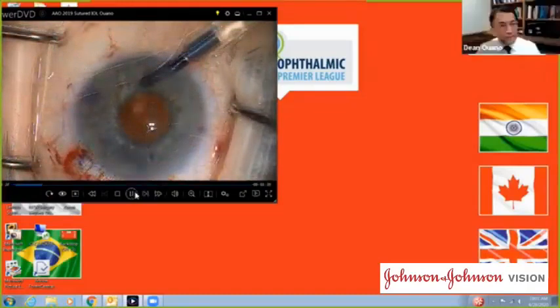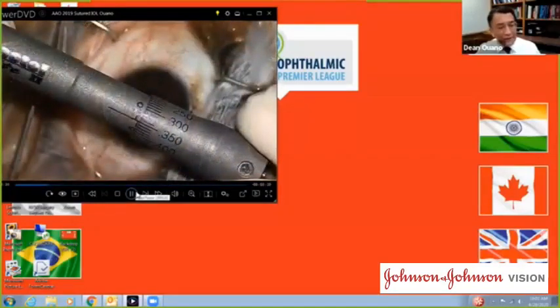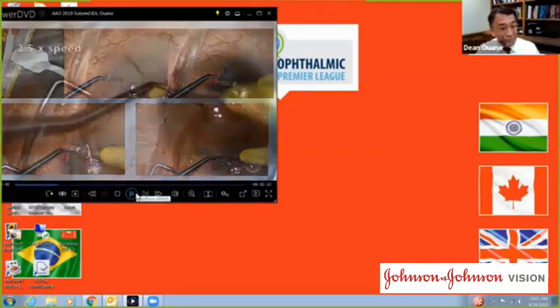A calibrated diamond knife is used to make a 250 micron deep incision in peripheral cornea. This is going to be 3.5 millimeters wide. It's important that this is 180 degrees apart. The construction of the extended length Hoffman scleral tunnel is important.